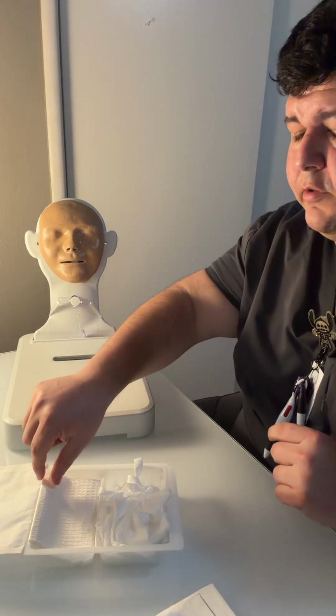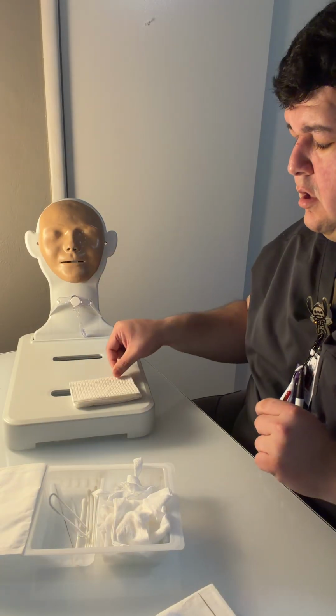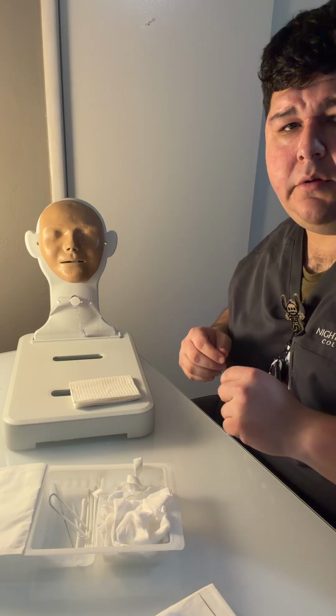And then pull out my sterile dressing field using the 1-inch border. The shiny part is the part that's on the underside. It's the only part that I can touch that would go down.